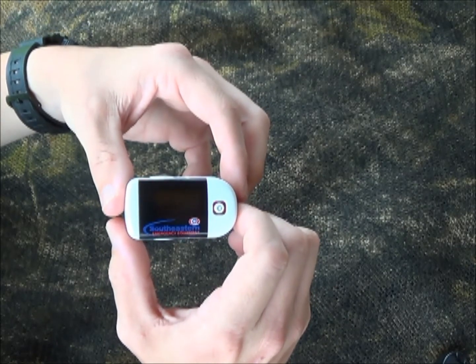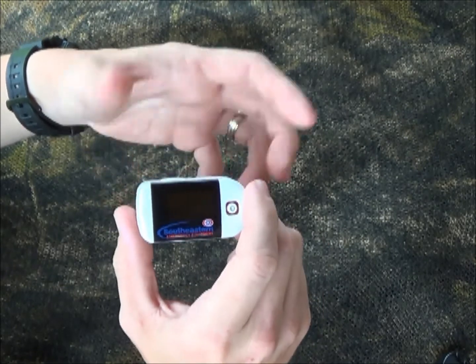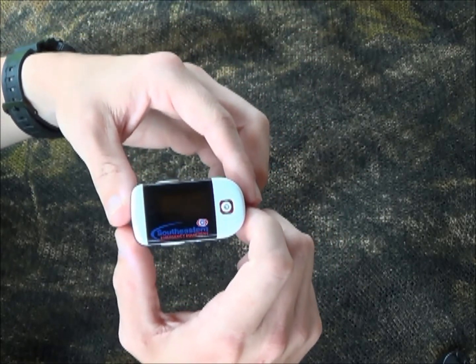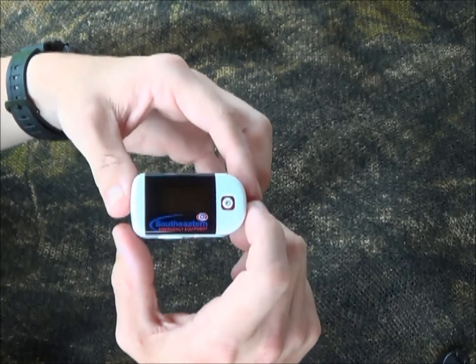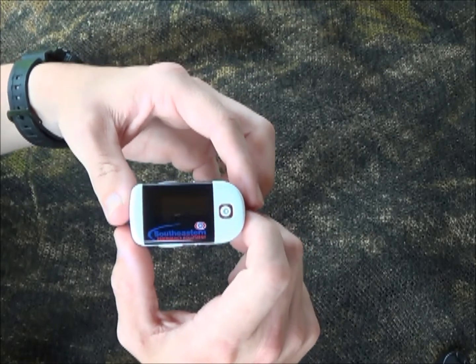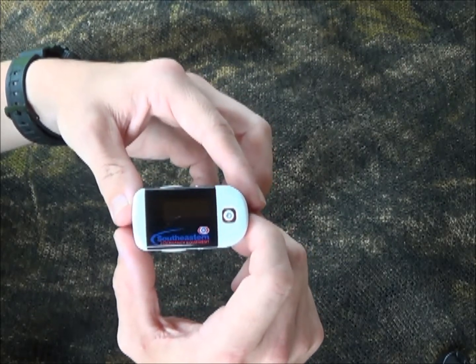Hey YouTube, welcome to another video from SkinnyMedic. If you've been in an ambulance before or been in a hospital setting as a patient, then I'm sure you've had one of these attached to your finger. This is a pulse ox. What it does is it measures the amount of oxygen attached to your hemoglobin in your bloodstream and gives it out as a percentage.